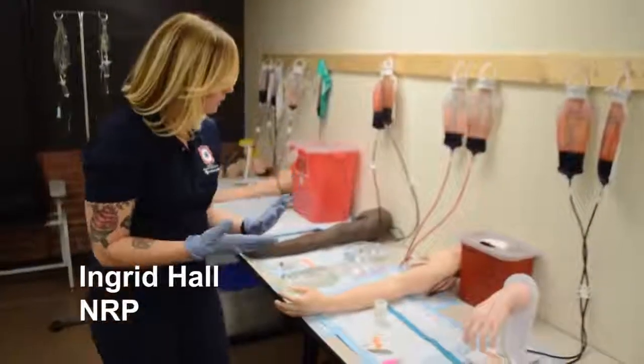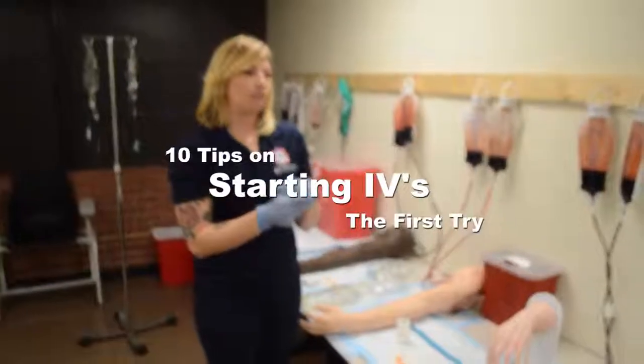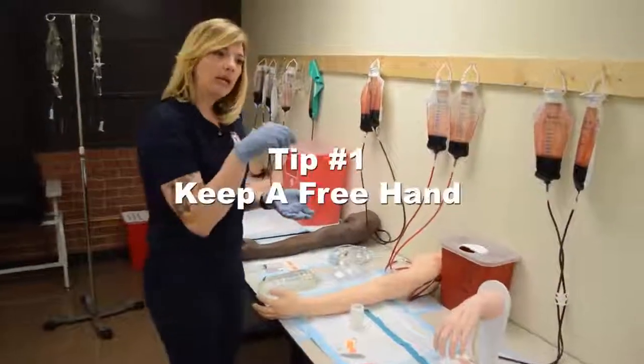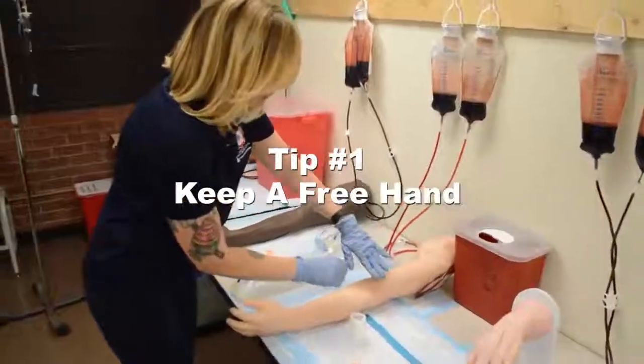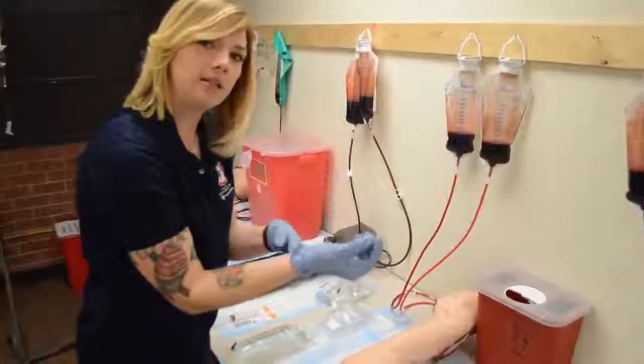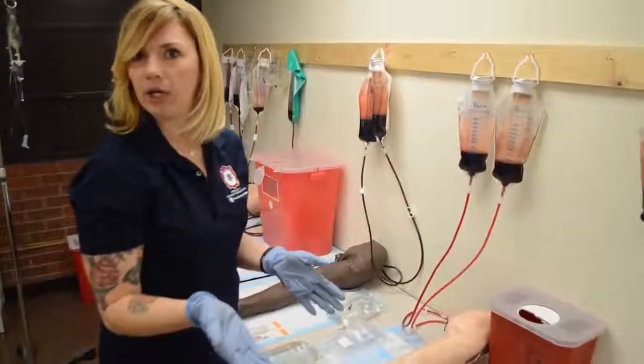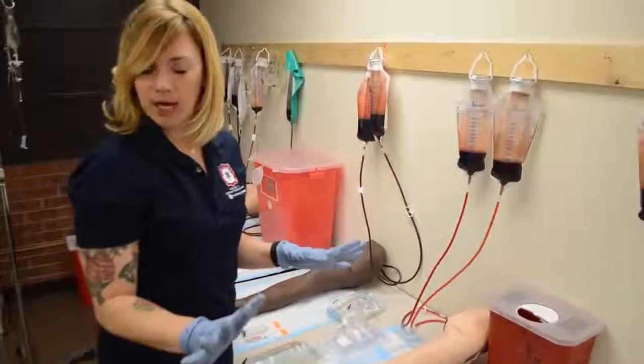What I like to think of is my opposite hand is like my guiding arrow. So if I'm in the skin and I'm having trouble finding my vein again, this hand is free. You always want to have a working hand and a free hand if possible. As medics, we learn over time you only have one hand ever. So you've got to do what you can with what you've got.